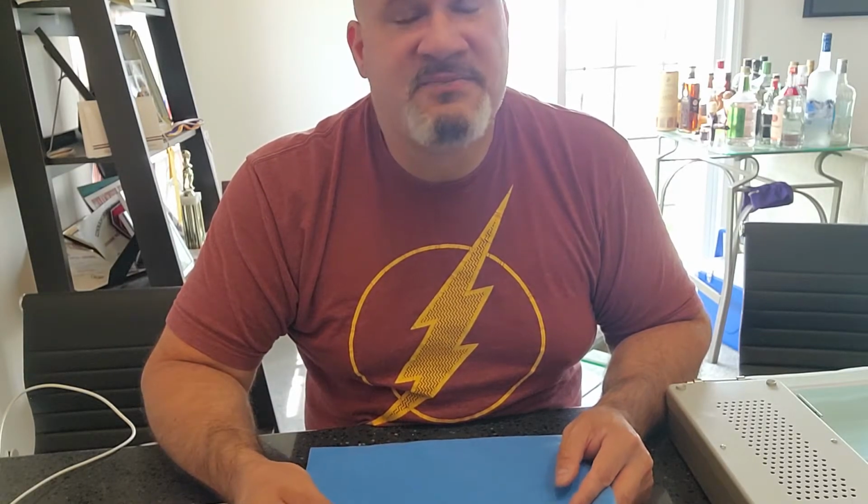So let's say the medical device has a dry time of 15 minutes. Well, Jesse, it's been validated for 15 minutes. Yeah, that's okay. But dry time has no effect on the sterility of an item. That is not part of the sterility assurance level of an item. So you can exceed the dry time.